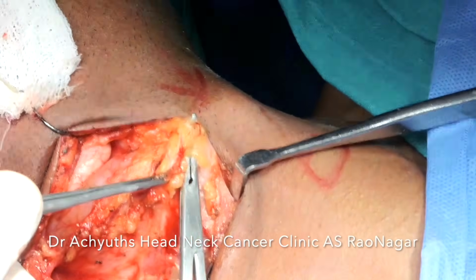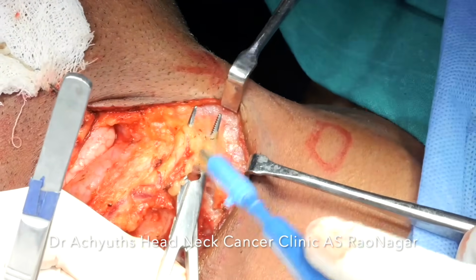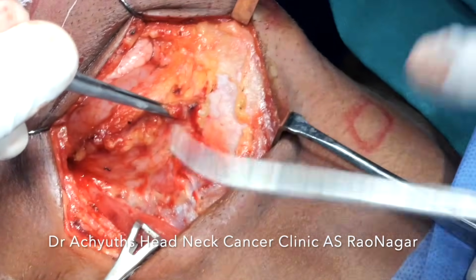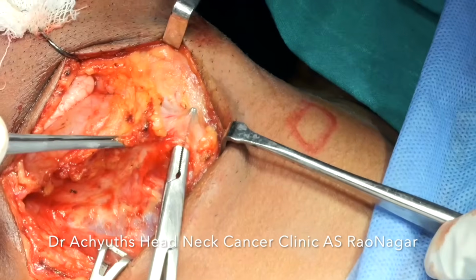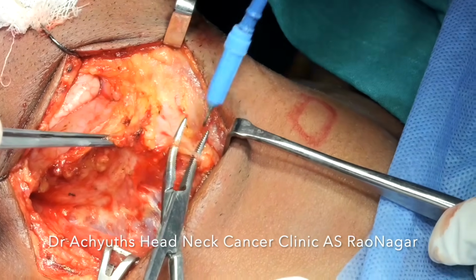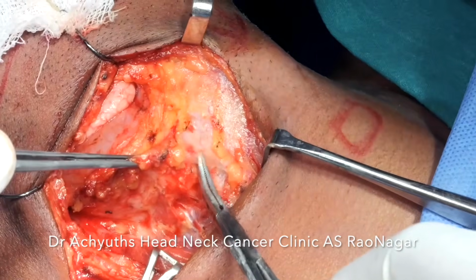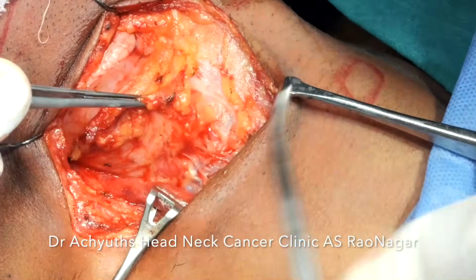Like any other surgery, even this we are doing layer by layer. Do not rush to divide the entire attachments on one side and then raise it completely. So we try to delineate from all the surfaces, superior, lateral, inferior and medial, layer by layer.